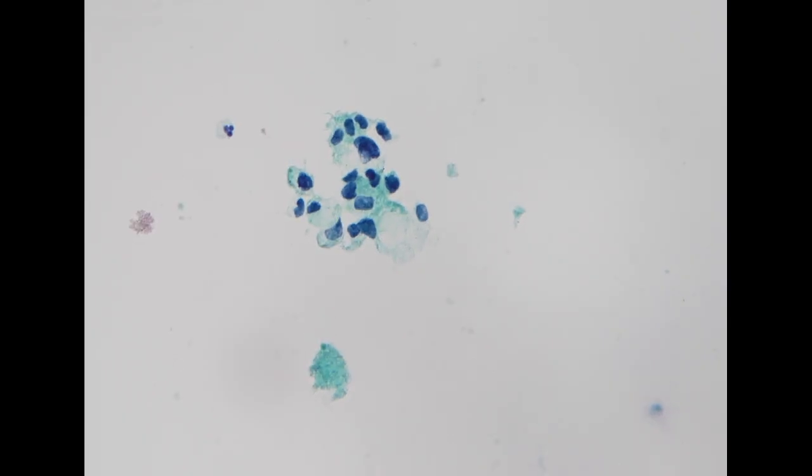So here are another few clusters of cells. Again, quite hyperchromatic, and relatively degenerative, so the cytoplasm is not well preserved. However, you can appreciate the polymorphism between the nuclei of the cells. So you see hyperchromasia, irregular nuclear contour, relatively degenerated. So this cell again seems to be atypical.